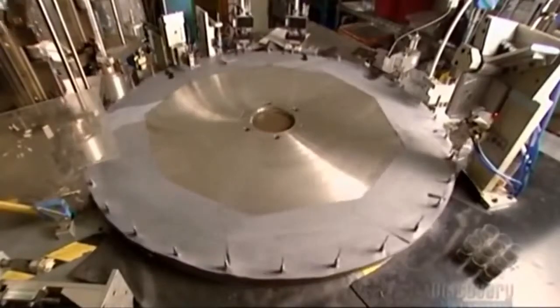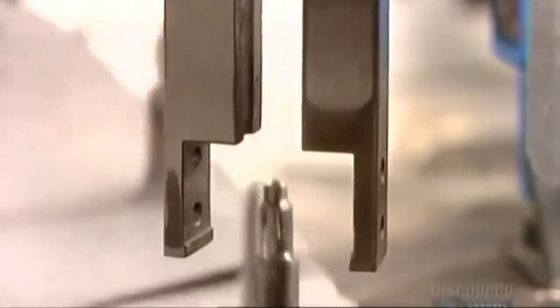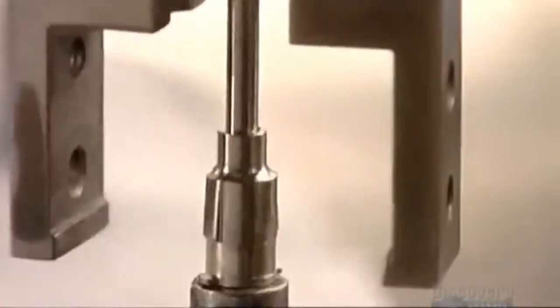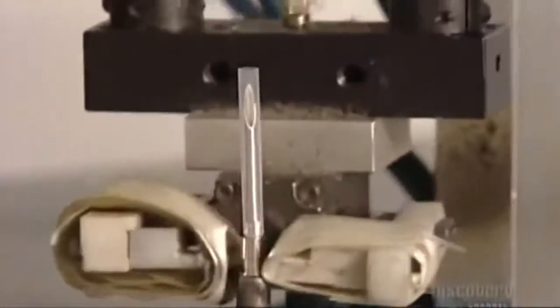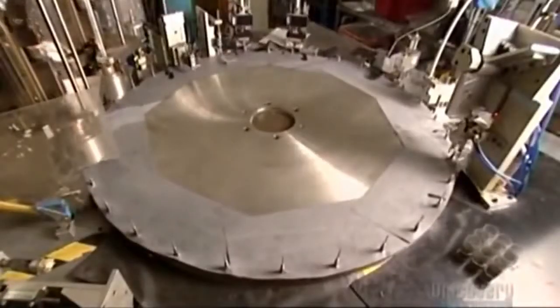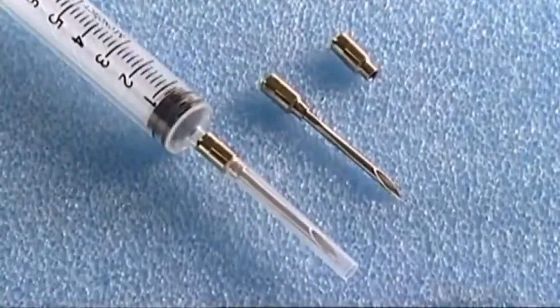Brass and nickel plated fittings called hubs drop onto pins on the wheel. The needles fall into the hubs, and metal fingers align them so they fit together precisely. The hub is the piece that will connect the needle to the syringe. Automated crimpers press the needle into the hub — sheer friction bonds them. Two metal pads on the same wheel position the needle, and a plastic sleeve drops down, encasing the pointed tip. Finally, a robotic arm lifts the needle off the wheel and drops it into a bin. The needles are now ready for you — but are you ready for them?